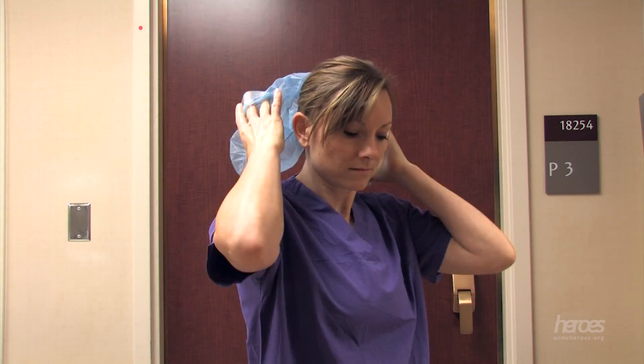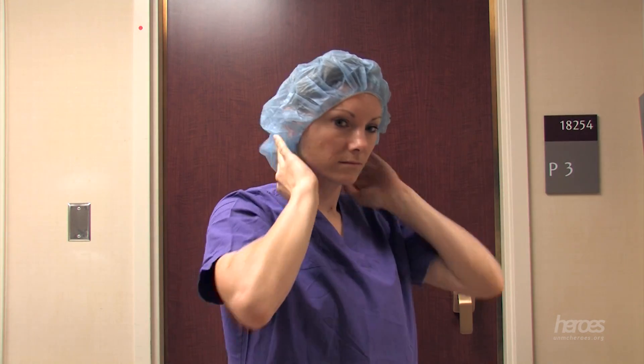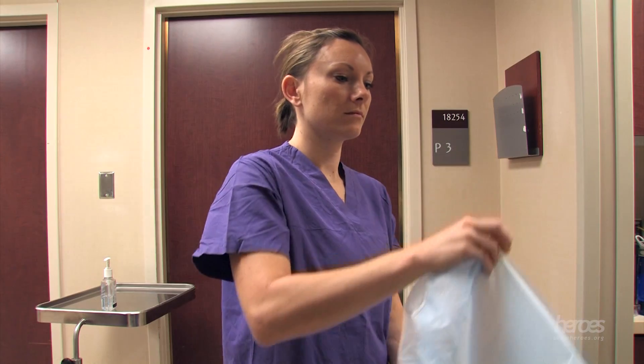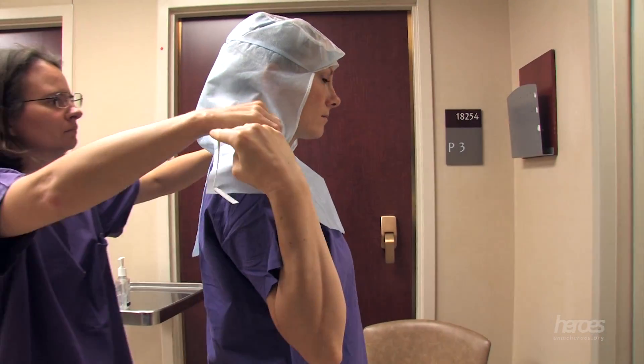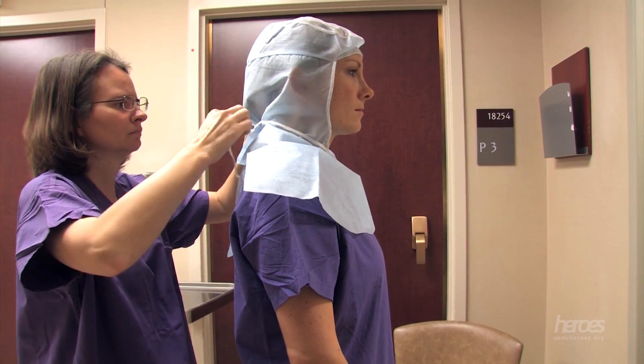Your head covering comes next. You can use a regular hair covering, which can be pulled down over the ears for extra coverage. For extended periods of use, a surgical cap has been found to provide a more comfortable experience and will also provide additional coverage around the head and neck. The surgical cap should be securely tied in a bow at the back of the head on the nape of the neck.